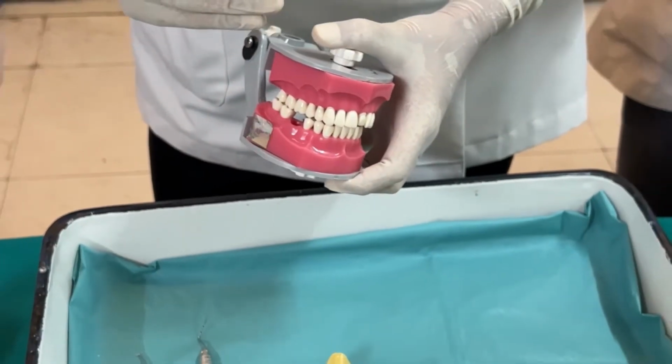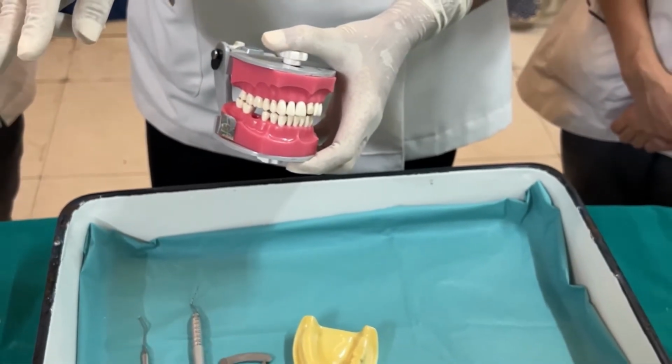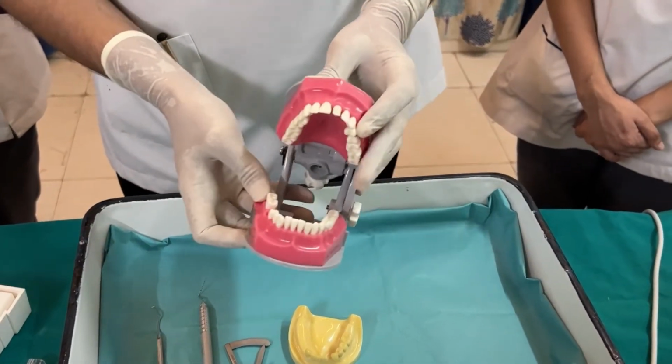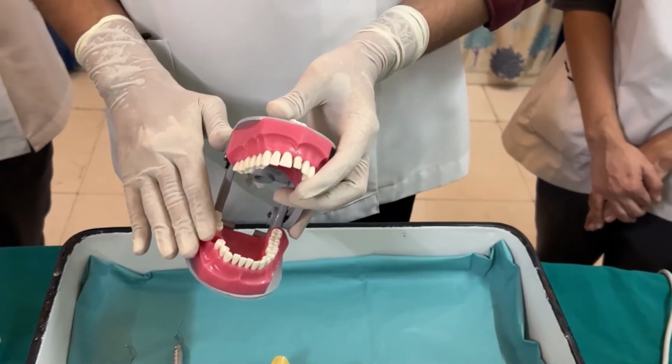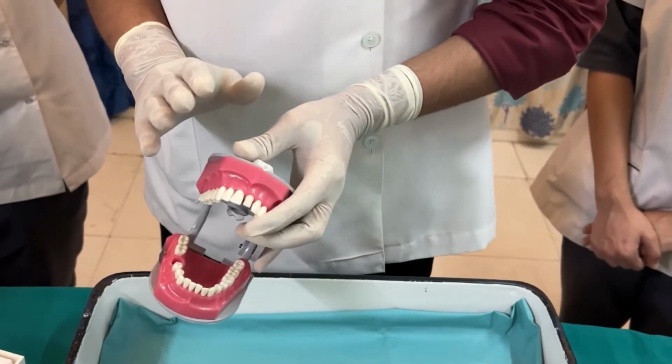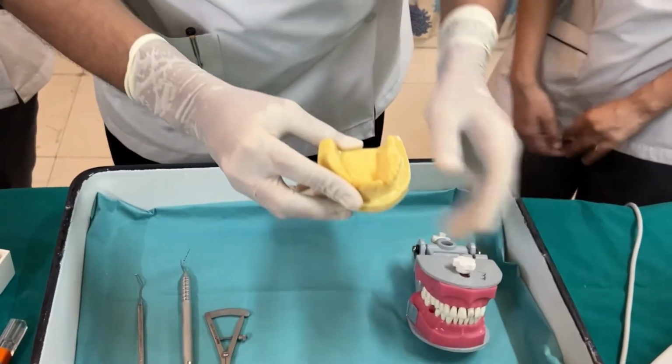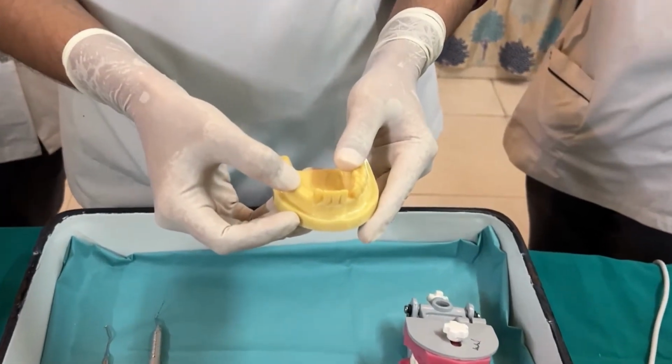So this is the 1, 2, 3 rule of implant placement. 1 mm buccolingual, 2 mm adjacent side mesial and distal, and 3 mm in the apicocoronal direction. So now I have decided that in this patient I would be able to place an implant. So what's the next step then? Let us say this is the area in which I want to place an implant, right?